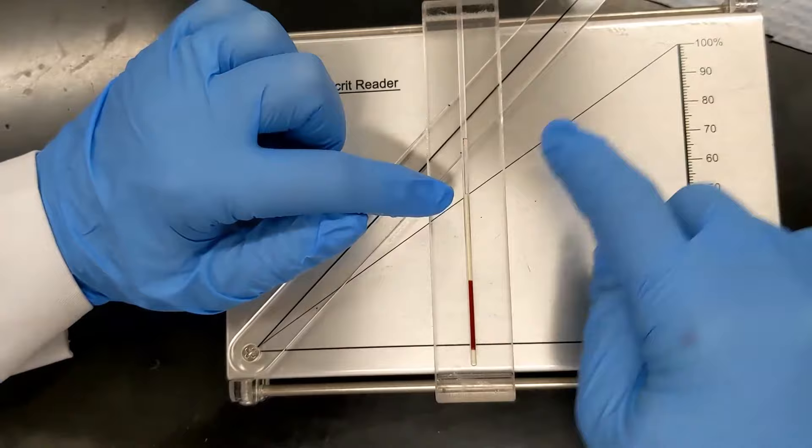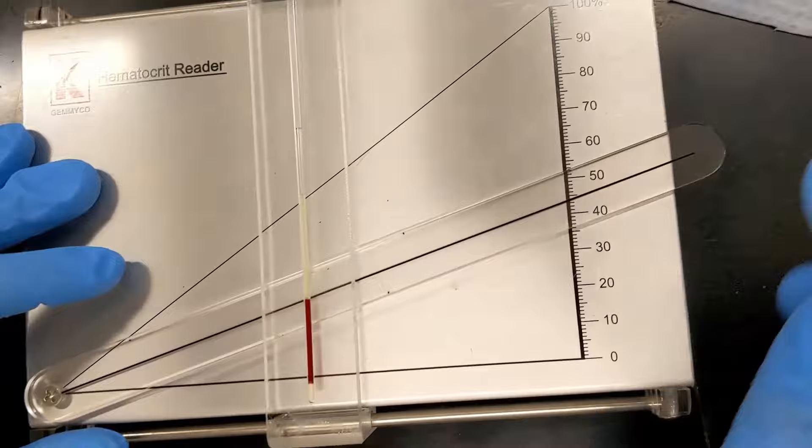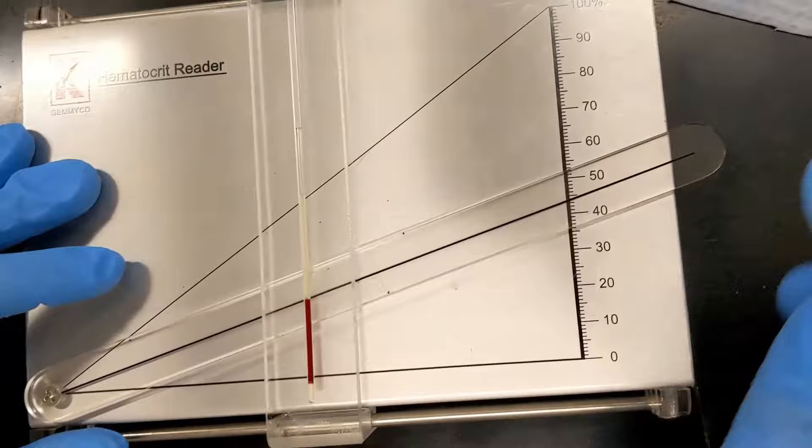Now you're going to use this ruler section placed on the top of your red blood cells, and that reads the hematocrit. So for our patient, it's exactly 44%.